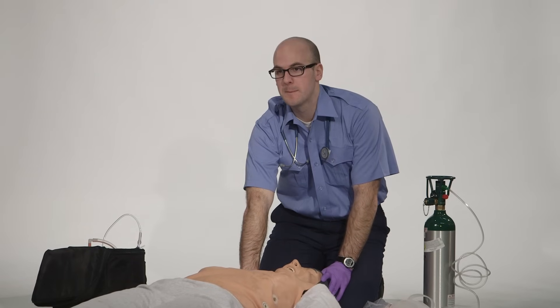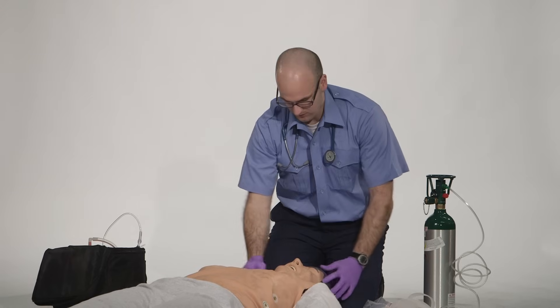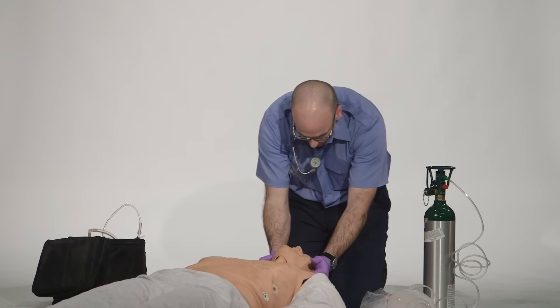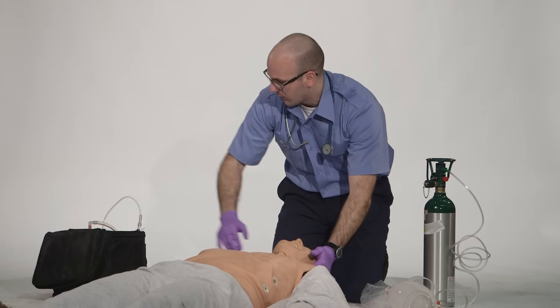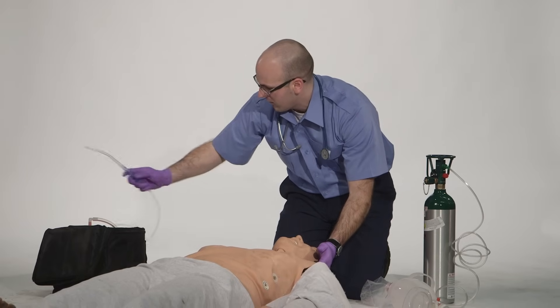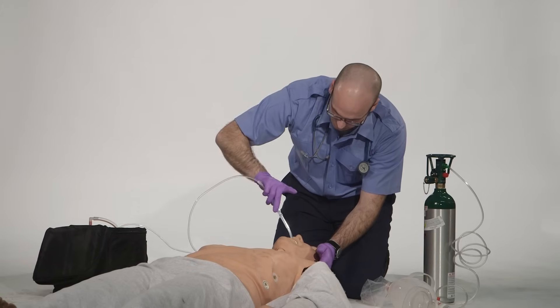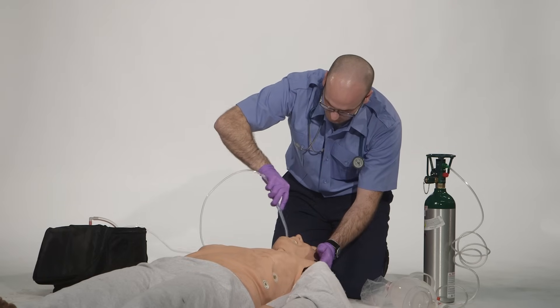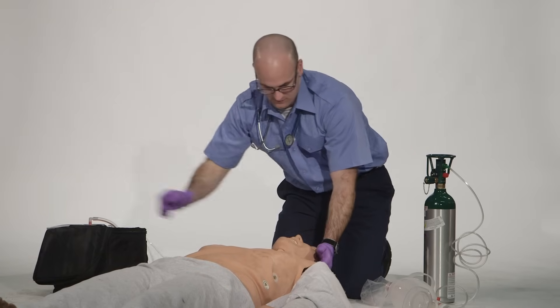Do I have a pulse? You palpate a weak carotid pulse at a rate of 64 beats per minute. At this point I will open my patient's airway. The mouth is full of secretions and vomitus. I'm going to suction the airway. I'll prepare my suction catheter, turn my suction unit on, insert without suction applied, and then apply suction, sweeping the mouth as I come out. The mouth and oral pharynx are clear.